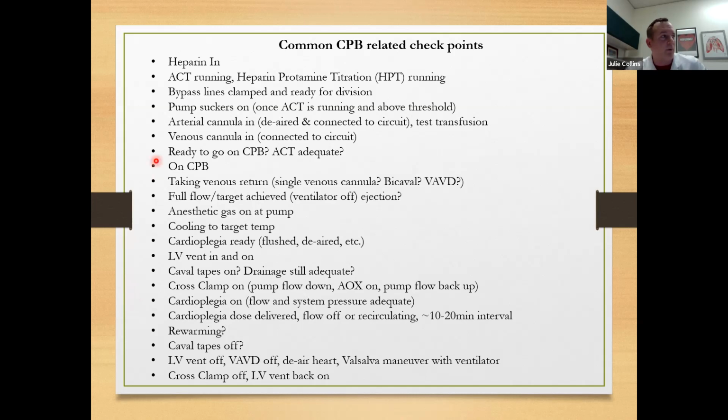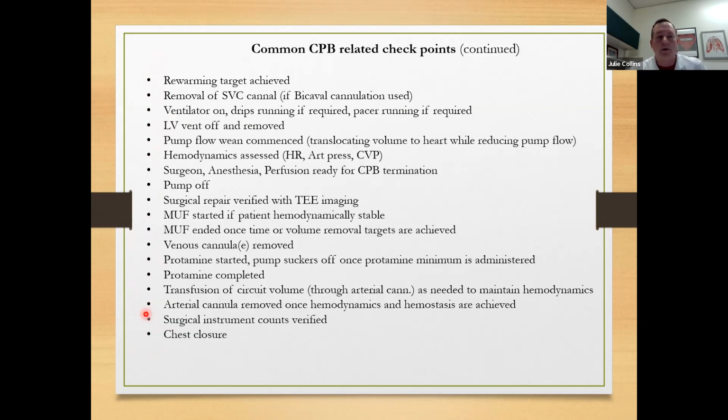So I'm not going to go through each item here. It's pretty self-explanatory, but you can see how all these items are in a specific order for a specific reason. And whether it's peds or adults, you're going to be following essentially that same timeline in some iteration.